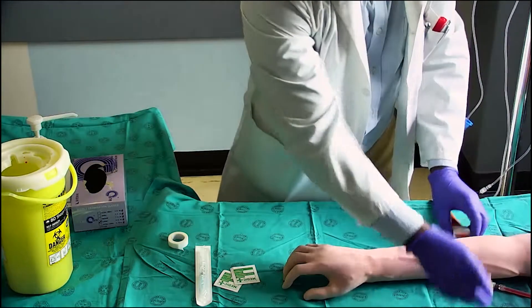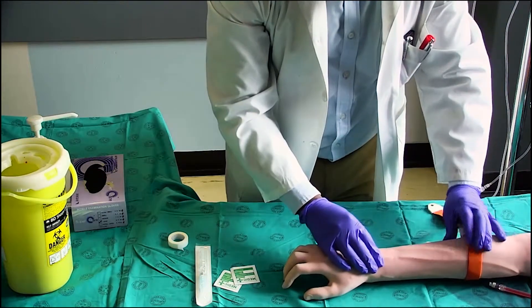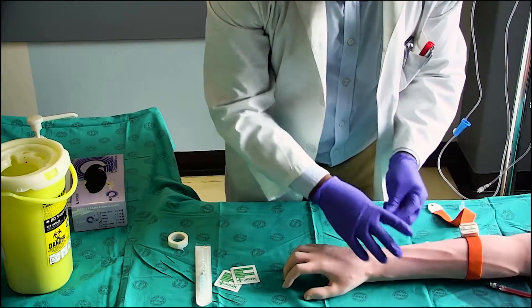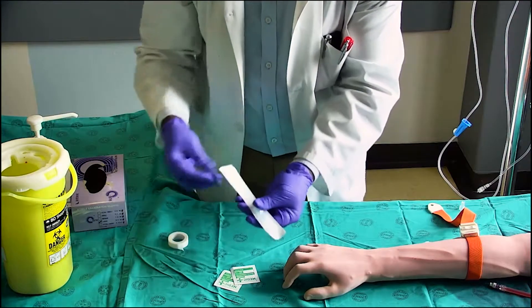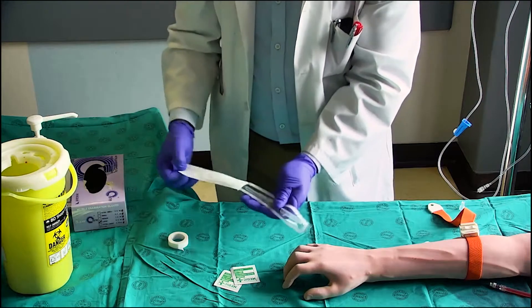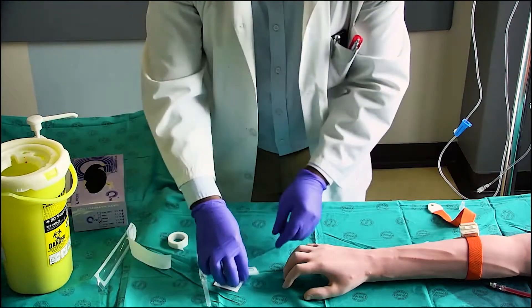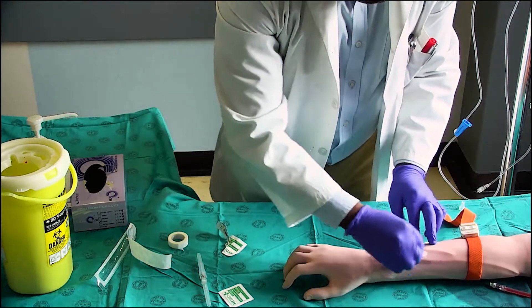Apply the tourniquet to an area proximal to the puncture site. Palpate an appropriate vein for the puncture. Set up your cannula. Clean the site using an alcohol swab and allow it to dry for 30 to 60 seconds.